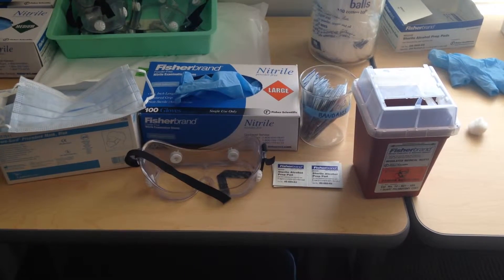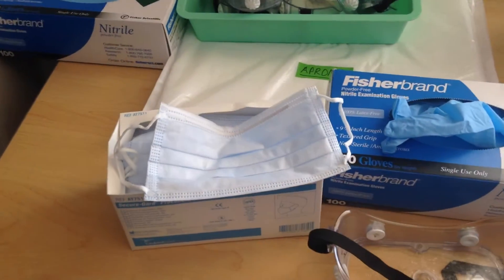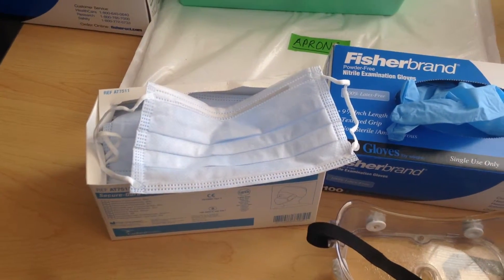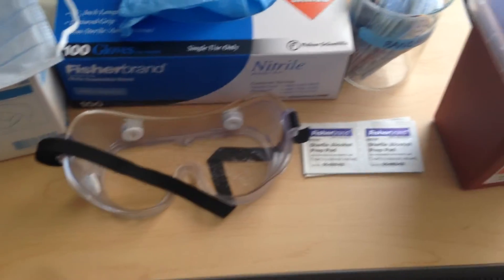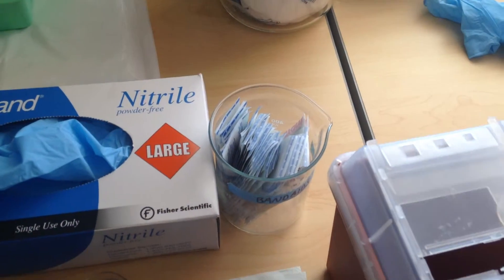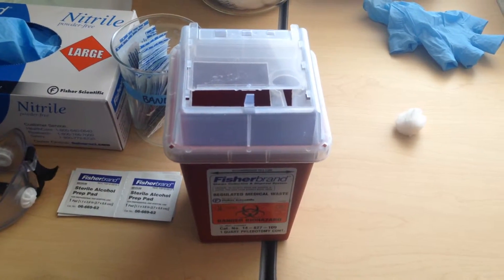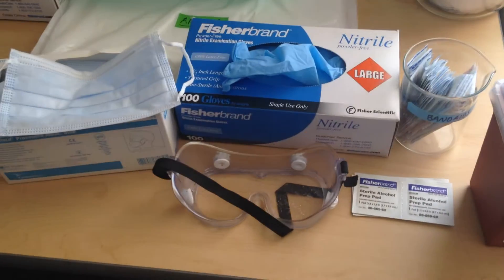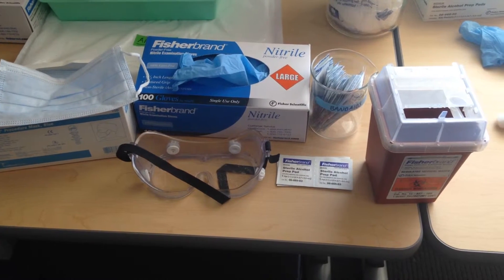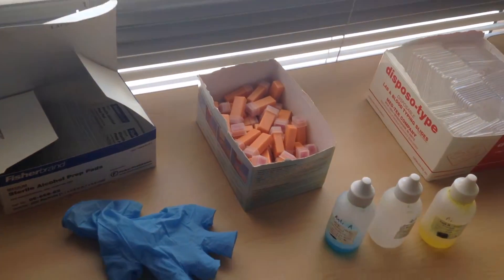First you need to make sure that you have all the safety gear available. You will need gloves — you have to put on the gloves — and also the mask, protecting glasses, alcohol swabs, bandages, and a sharp object disposable container.